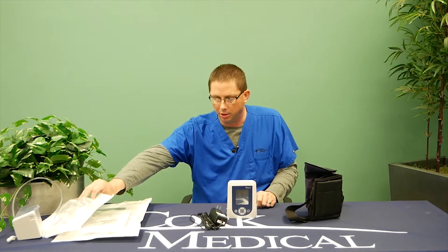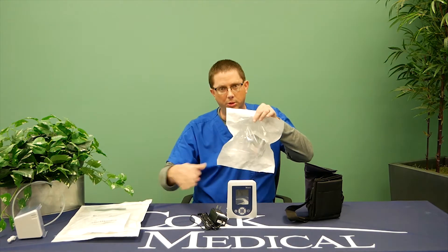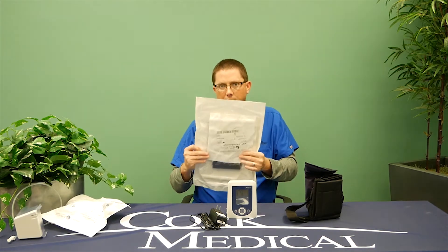Also in the box you will have items called canisters, which we'll discuss further, and you'll have items called a dressing kit.